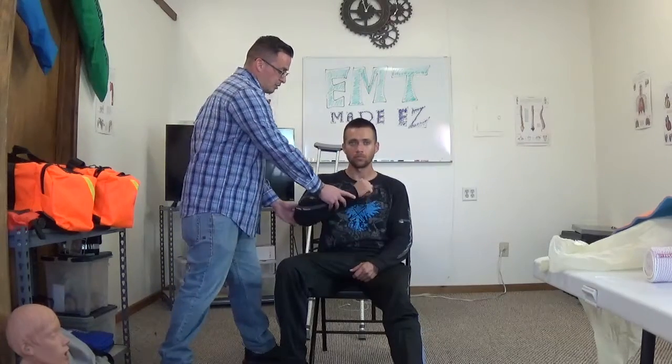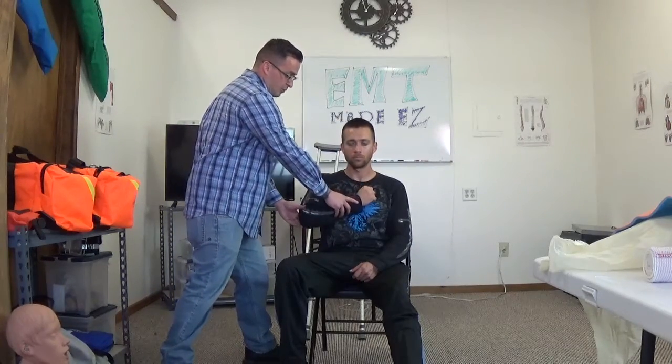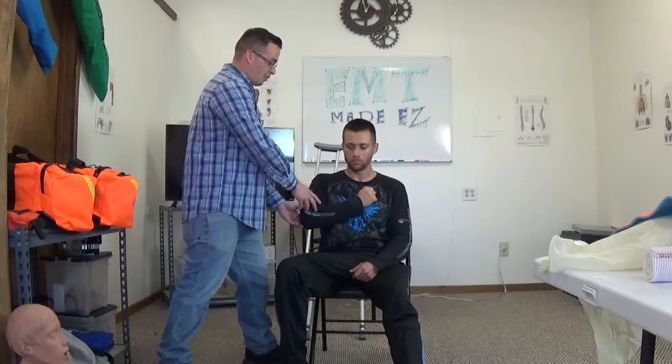Next you want to identify where the long bone fracture is. For this scenario, the long bone fracture is on the forearm of the right arm — a radial bone fracture. I'm going to get the right arm and stabilize it. I would have my imaginary partner maintain and stabilize this, or I would have my patient stabilize it.